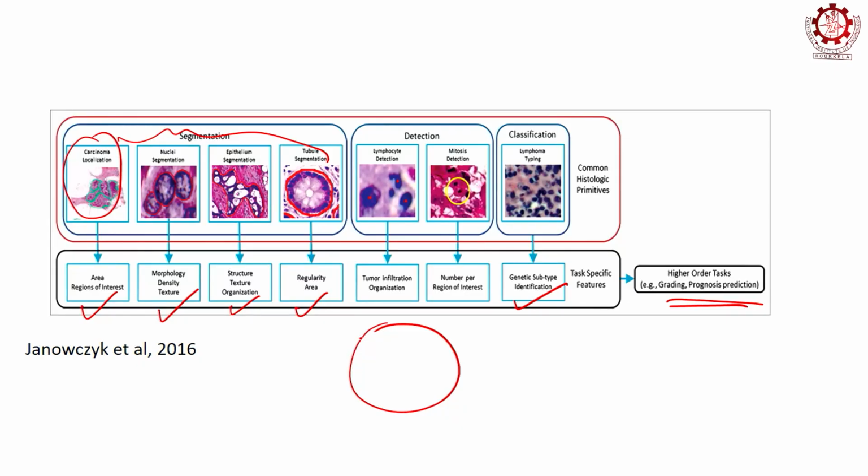And how do you stitch images? For those of you who have some image analysis background, I think you'll know that. For others, let's simplify it: you have one circle here, and you can't take the image of that entire circle in one go. So you take one portion first, and then you take the image of another portion. You have to identify some landmarks. This is one landmark, this is another landmark, and you identify the same landmarks here, and then you stitch them.